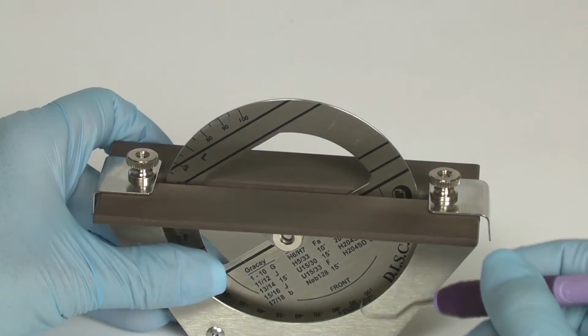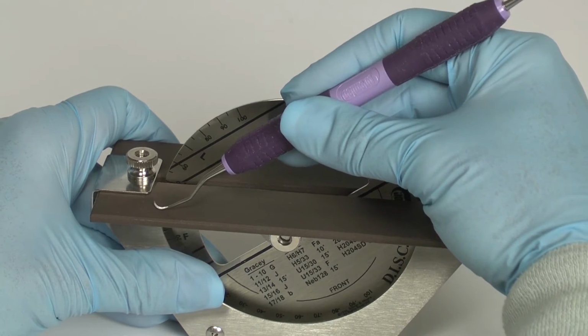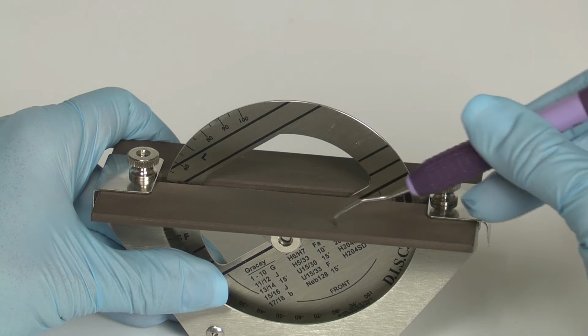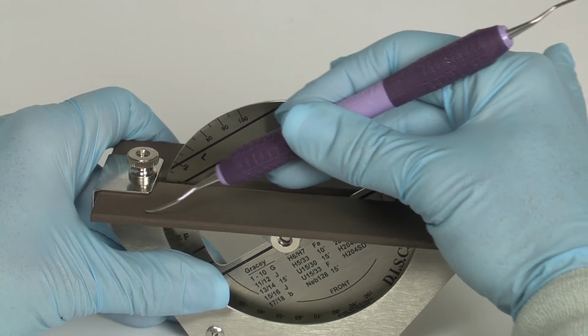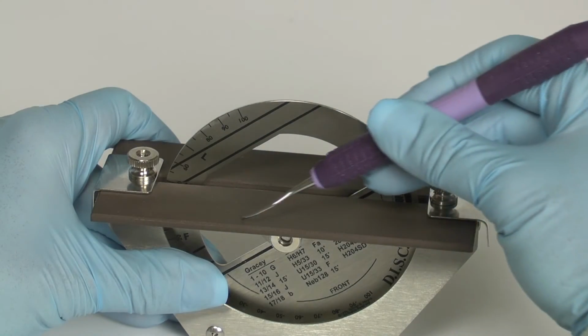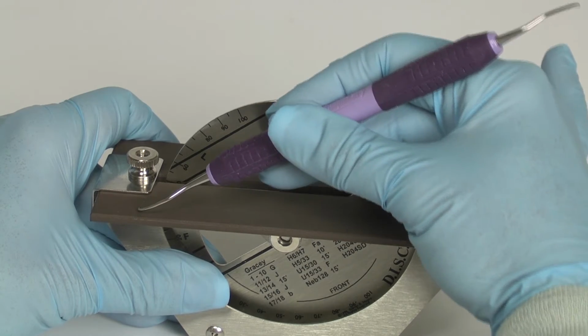When placing the cutting edge on the front stone, the toe faces the wheel as the handle of the instrument is aligned parallel to the bold reference lines on the wheel. Then, simply move the instrument blade across the stone while keeping your wrist steady so the instrument remains aligned with the bold reference lines during the entire stroke.